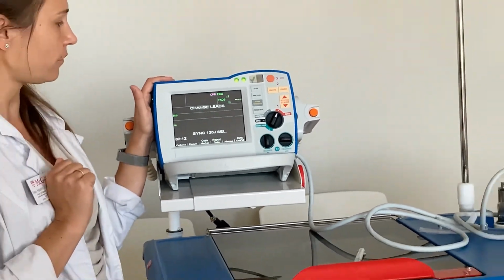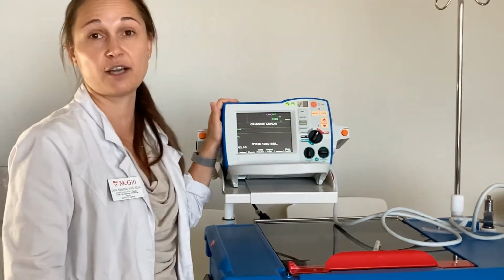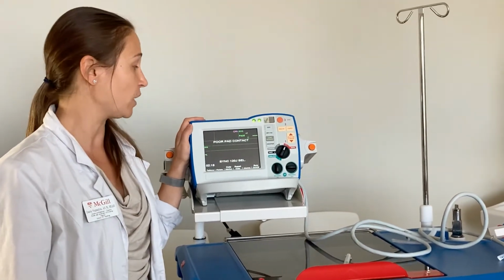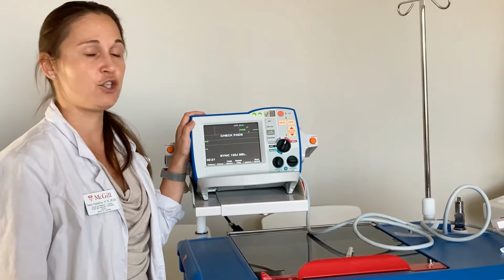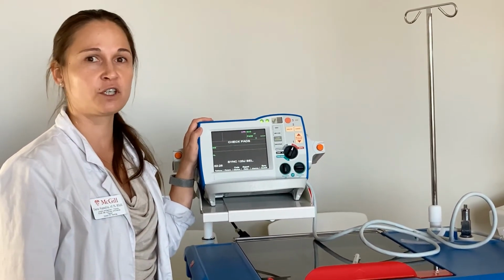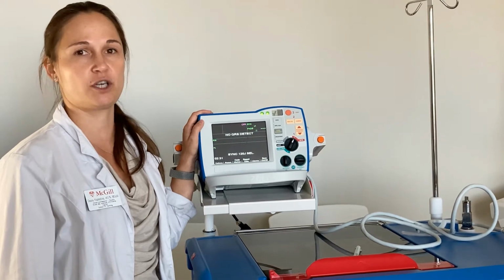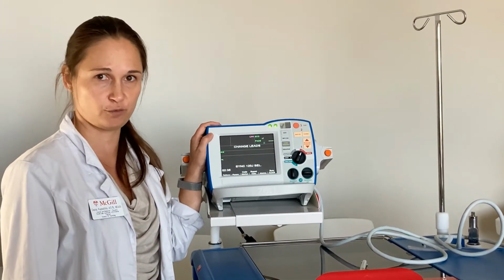wave. Okay, unfortunately, our dummy is a dummy, so it doesn't have a heart rate or rhythm, so we can't see those right now, but you will know that your defibrillator is syncing when you hear little beeps and when you see little dashes on top of each QRS complex. That means that you are synced to the patient's cardiac rhythm and you are able to cardiovert.